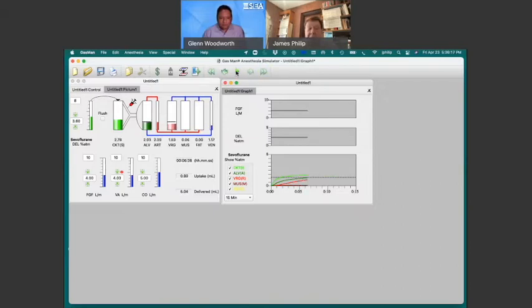Now, I paused it on purpose when the alveolar partial pressure or concentration has gotten up to 1 MAC. Notice that the vessel-rich group isn't really there yet. And if we look at the simultaneous graph of this, we can see that it hasn't reached there. The clock over here says we are at 6 minutes and 28 seconds of simulation.